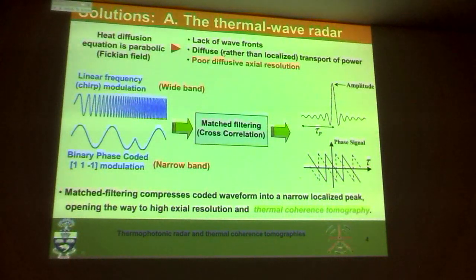So this field is not going to be very good for getting information from 3 centimeters below the surface, but for things that are close to the surface, it's great. It's also good in applications where there is so much scattering of both the optical and maybe the acoustic component, such as in hard tissues, in which case photothermics competes quite efficiently with photoacoustics.